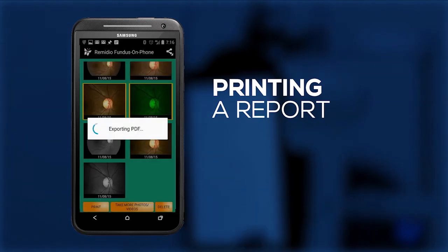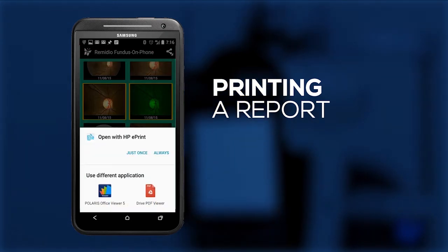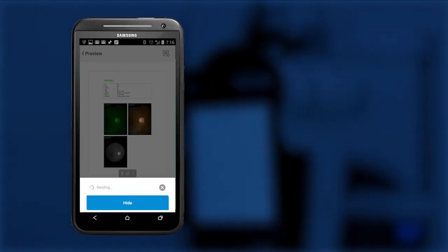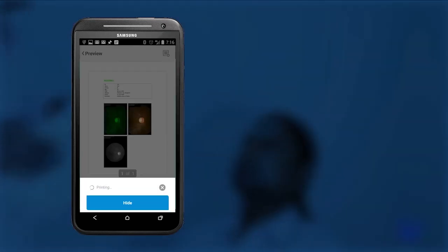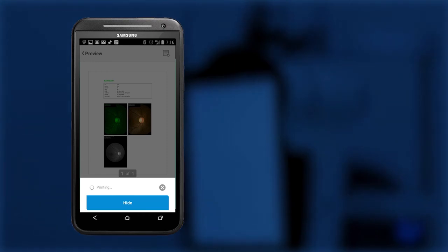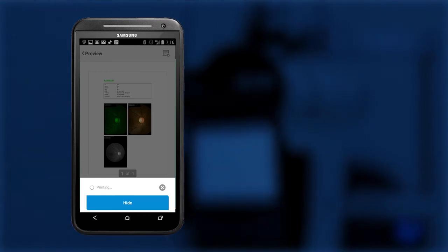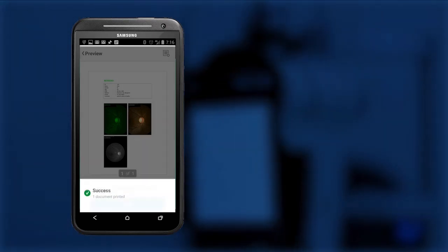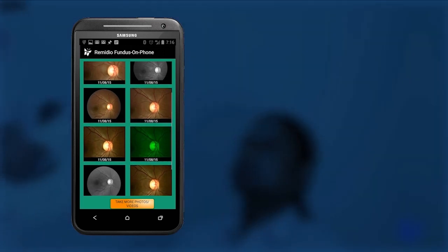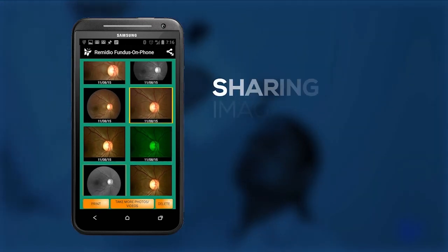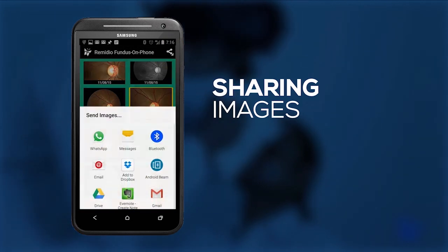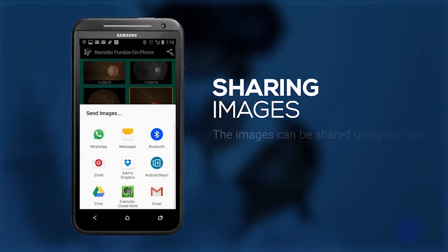Use the default viewing application in your phone to view the report, or an HP application to print the report. Select the images by pressing down on them for 2 seconds, then click on the Share button to choose an appropriate sharing application.